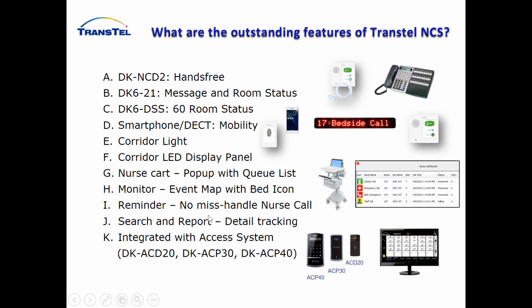The reminder will generate a beep to make sure no nurse call is mishandled. If any unattended nurse call still exists, the reminder will continue beeping to remind that some nurse call still needs to be handled.